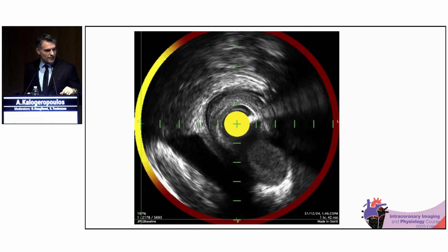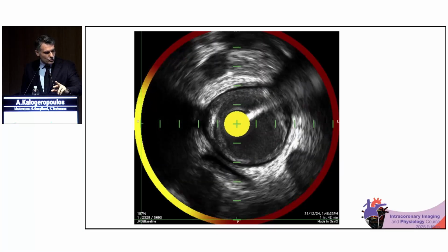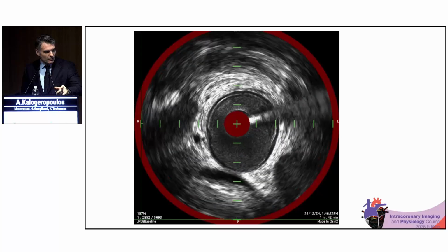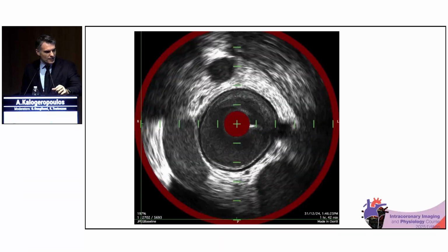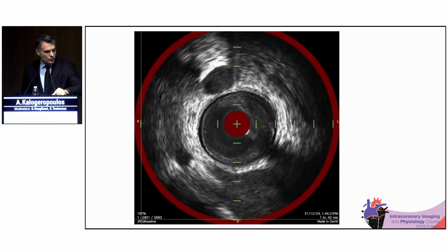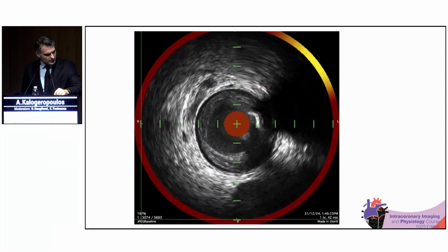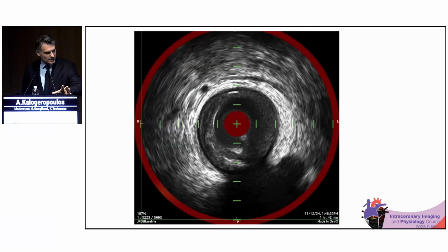So we can appreciate here that actually we have pretty tight lesions. In both diagonal branches, we have mixed fibrous plaque, we have calcific plaque, and now we can appreciate even before the diagonal, as the pullback is running, that there's a fibrous, huge plaque burden. I'm going to show you the measurements next. And again, small luminal area. I'm going to let the IVUS run. We can see the yellow part of the arc. That means that this plaque is filled with lipid.